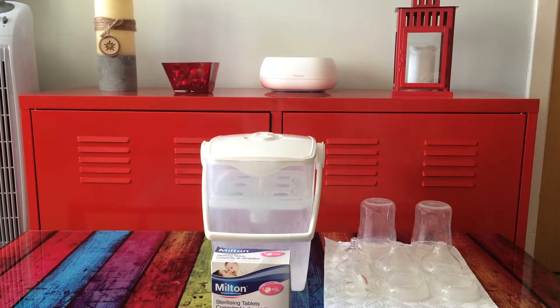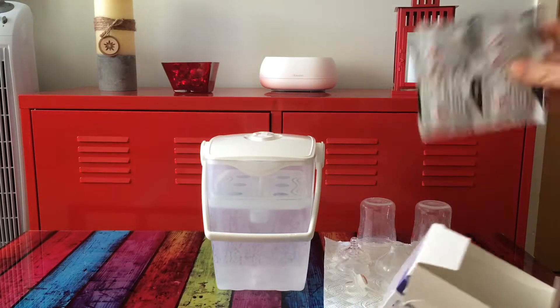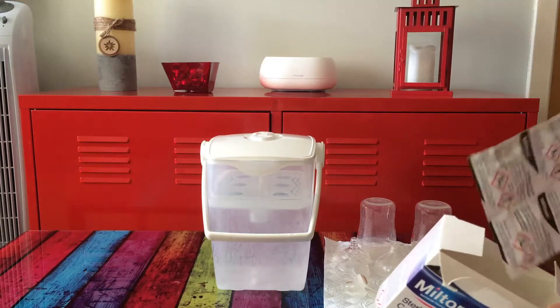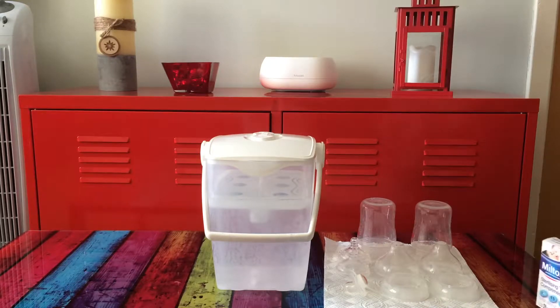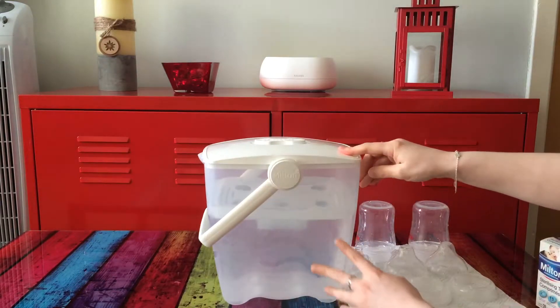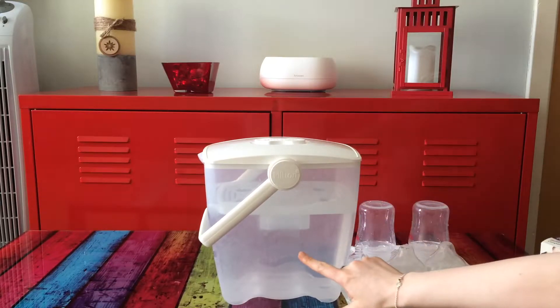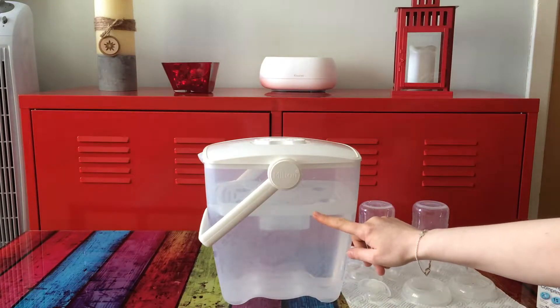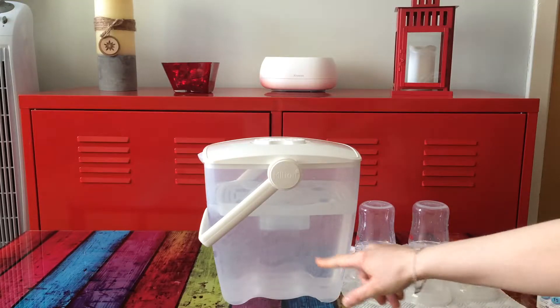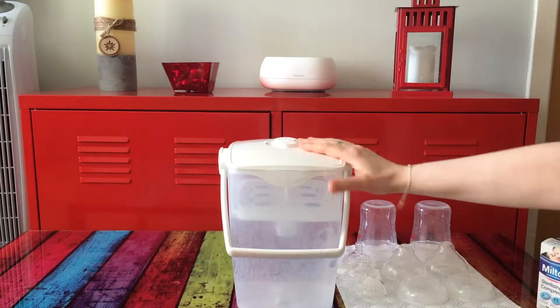I already have put fresh water in and one Milton Sterilizing Tablet. It comes in packs of four. I have filled it up to the 5 litre mark. If you only fill it up to the 2.5 litre mark, you only put half a tablet in to get the right solution to sterilize.